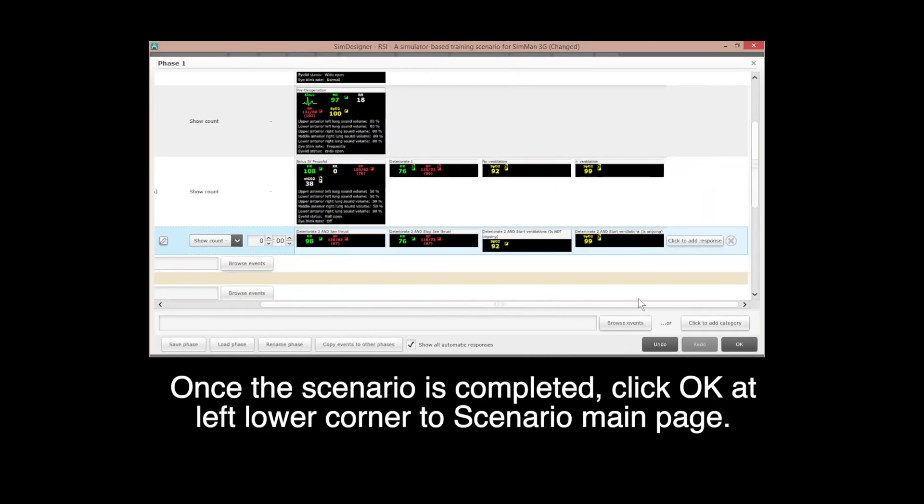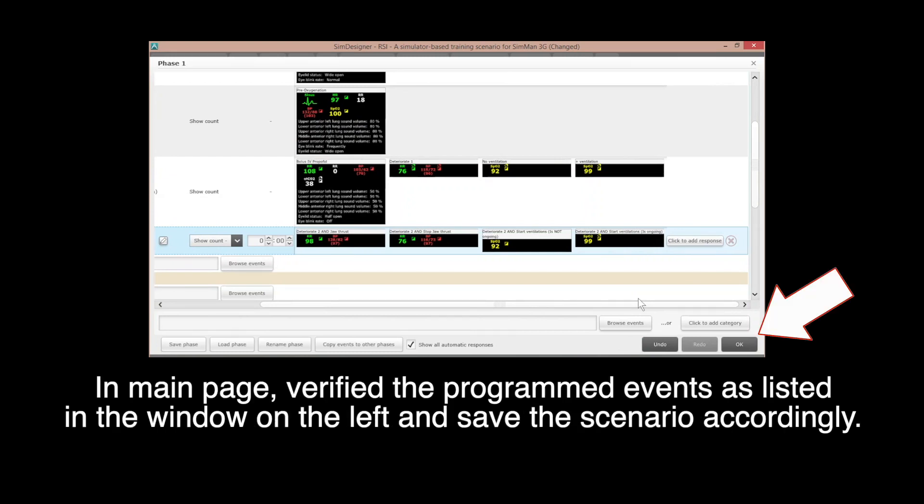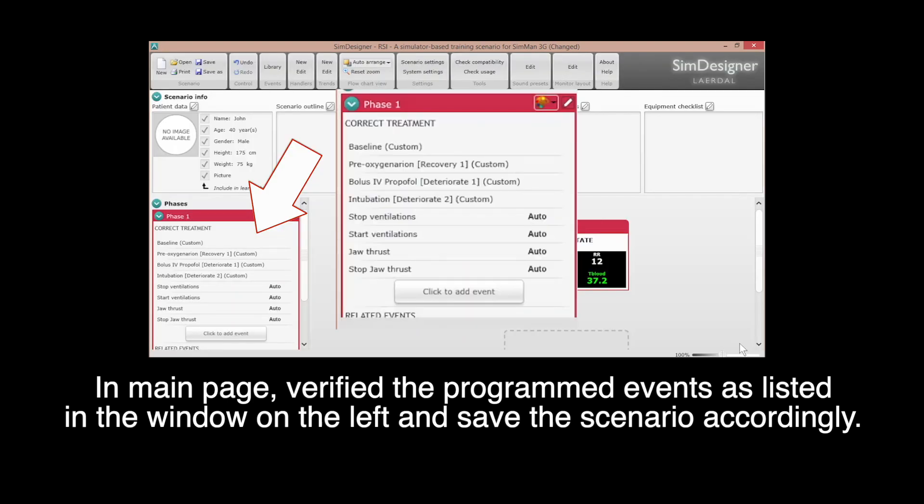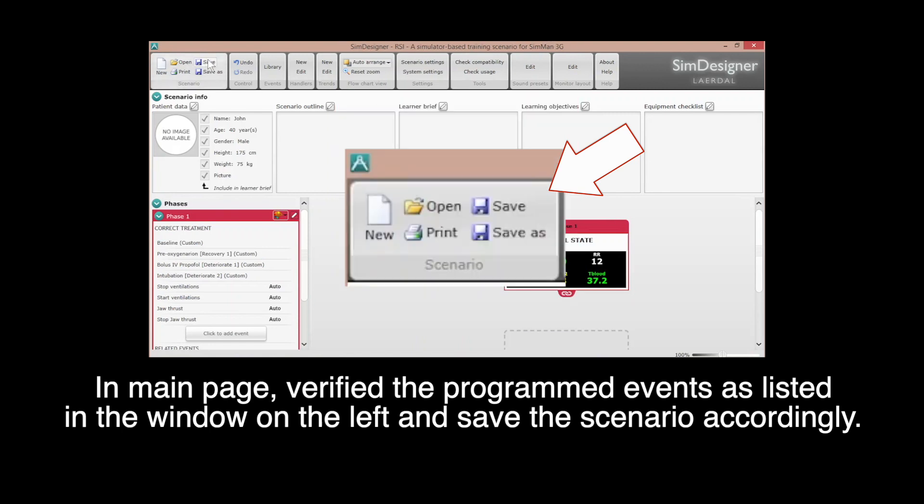Once the scenario is completed, click OK at the left lower corner to scenario main page. In main page, verify the programmed events as listed in the window on the left and save the scenario accordingly.